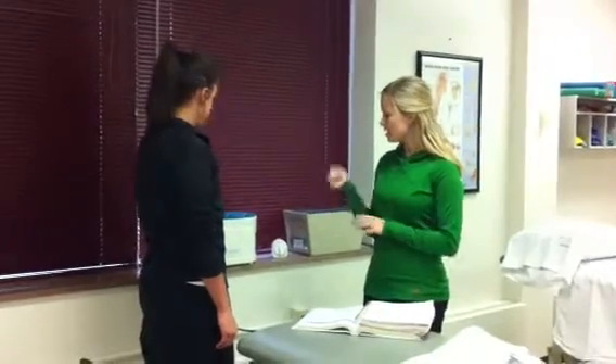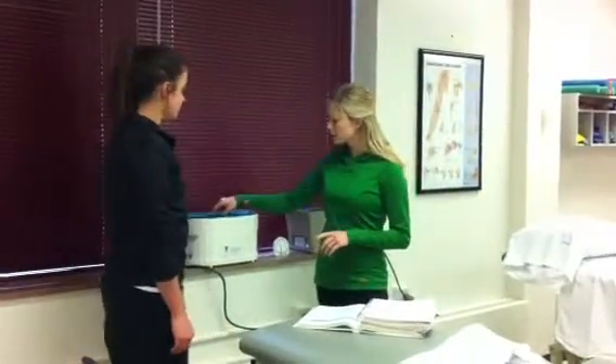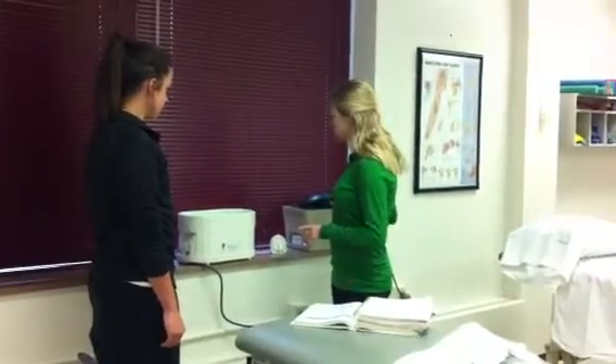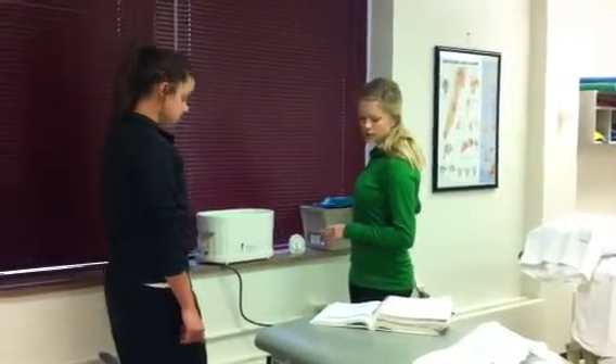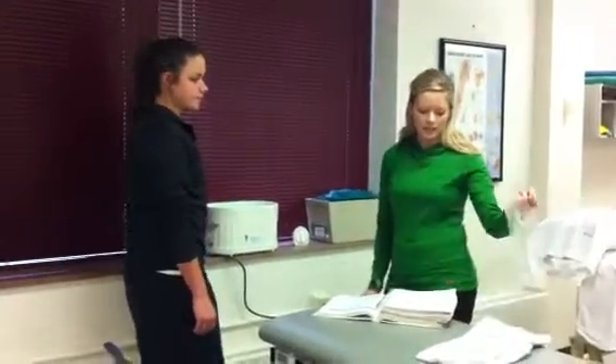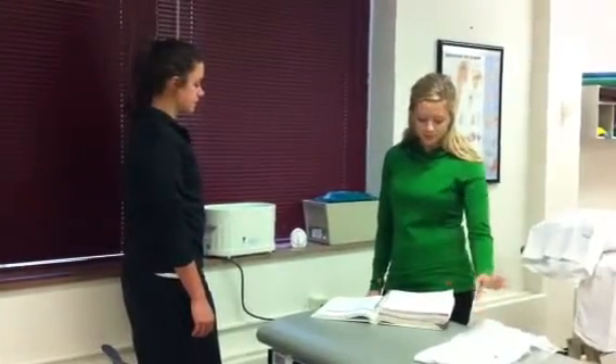You want to start out by checking the temperature of the bath. Let it be around 126 degrees so that it doesn't burn your patient. Then make sure that you have a plastic bag and a towel ready.